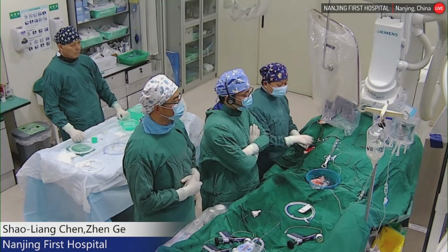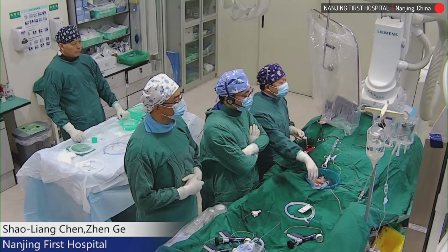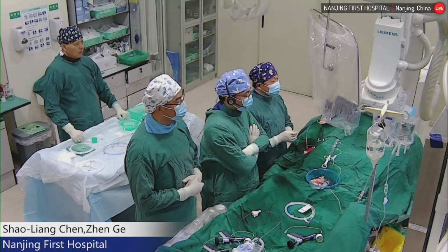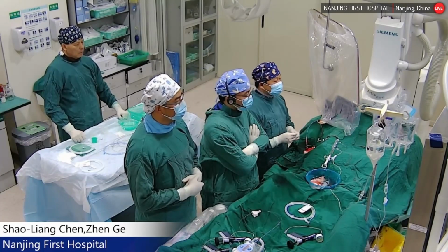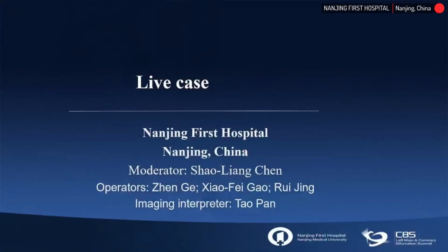Okay, thank you, Professor Chen. I'm very honored to be here to navigate for the mainstream 360. First of all, I want to introduce our team. On my right is Dr. Gou and Jerry, and the nurses, and the image technician Dr. Pan. And firstly, I would like to ask Dr. Gou to introduce this patient's clinical information.